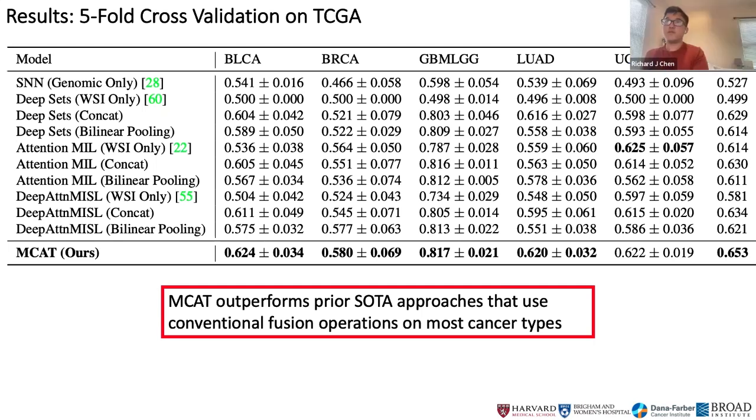I think for tissue microarray cores, from my understanding, they aren't often used in current clinical translation. However, I think some diseases, such as a lot of the blood cancers, lymphoma, do use TMAs.